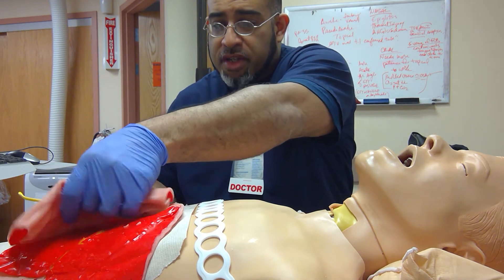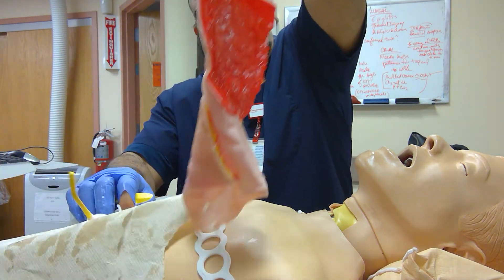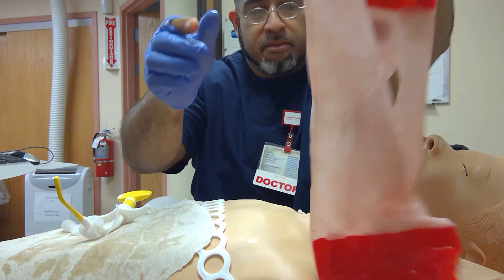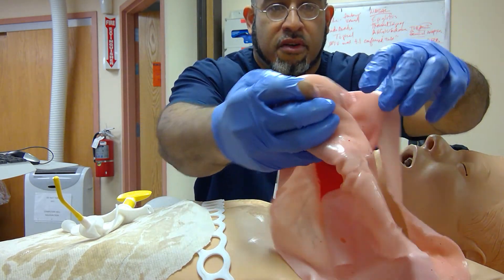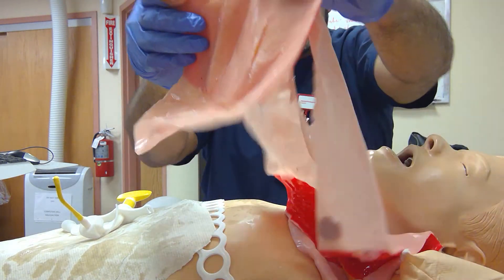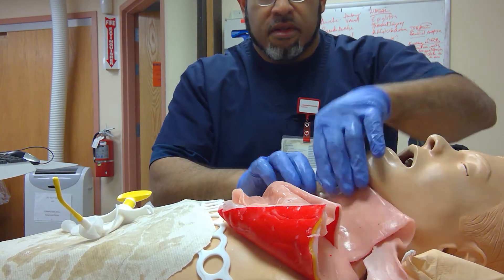I'll provide the artificial skin that I did mention, borrowed from Trauma Man. See — skin, fat. I can make this multi-layer because it's very difficult. Creating our artificial thick neck. Got a prosthetic issue for this mannequin. Can't make it easy — life ain't easy.